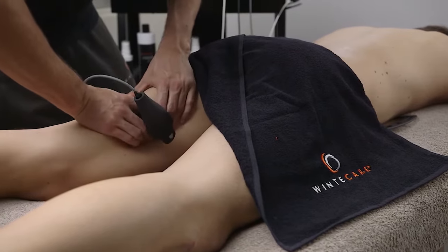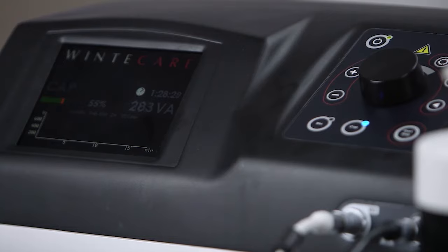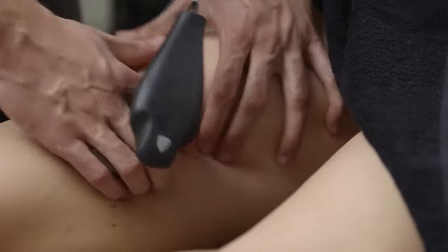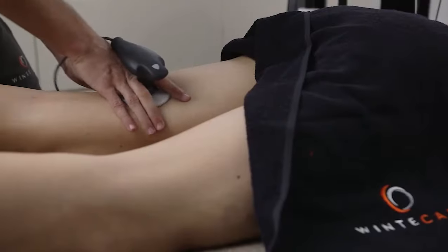Thanks to those characteristics, the device allows to transfer from 1 to 300 Joules per second, up to a maximum of 18,000 Joules per minute. This guarantees enormous flexibility in the management of therapy times, making it a fast and safe instrument.